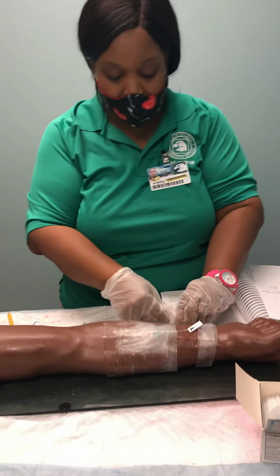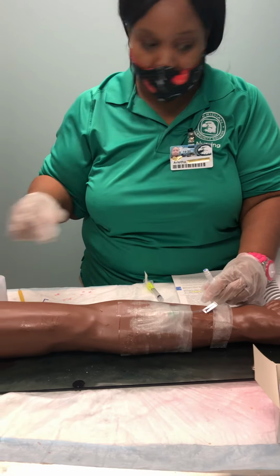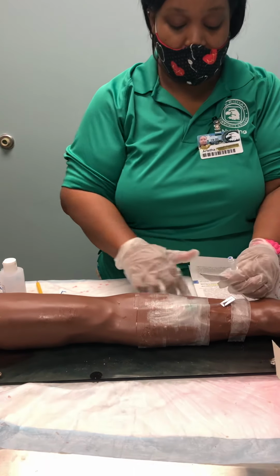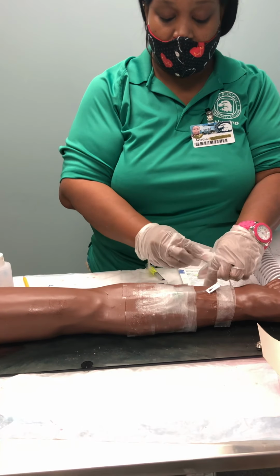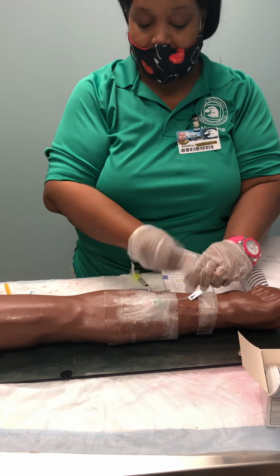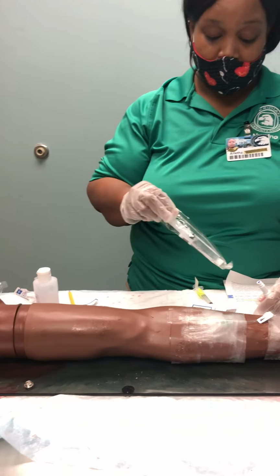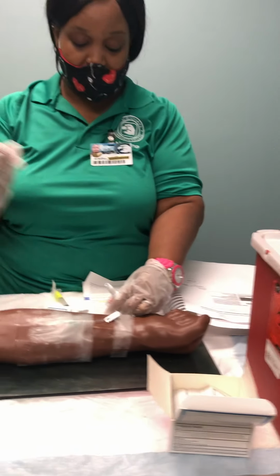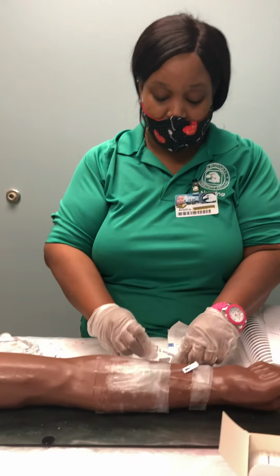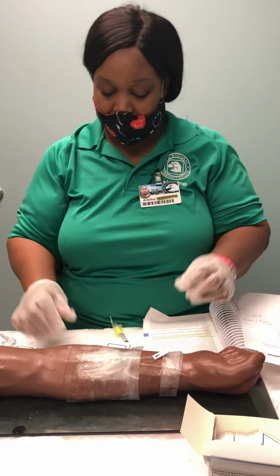I will cleanse and clean the port for 30 seconds. And then I will flush it. Then I will give the medication. And then I will flush it again. And then I will still monitor the patient for any adverse reaction with this medication.